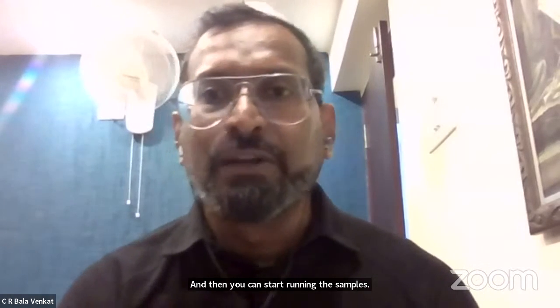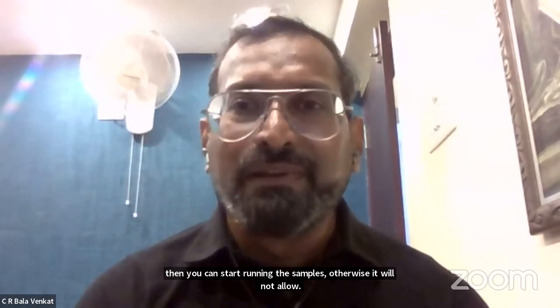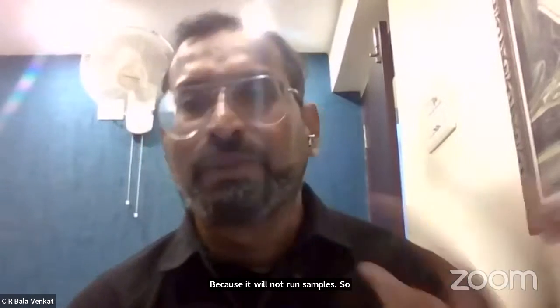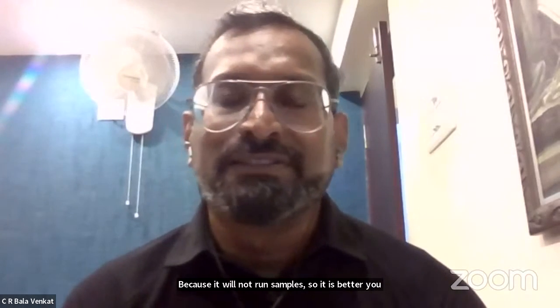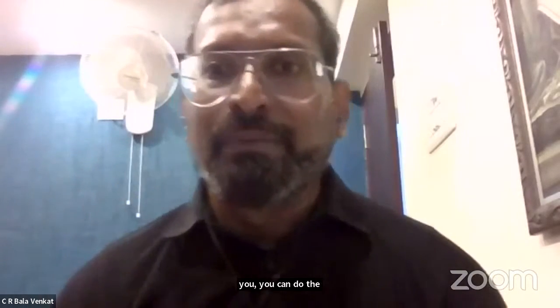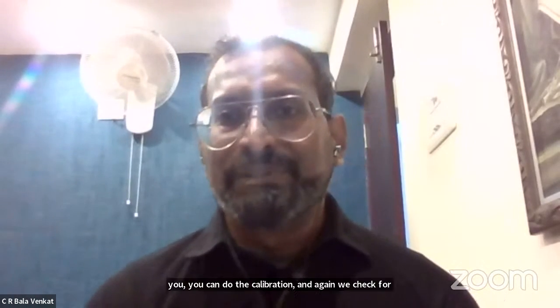If the Westgard rule is activated, then it will be a bit challenging because it will not run samples. So it is better you manually check, then you can do the calibration and again recheck that particular parameter, and then you can run samples.